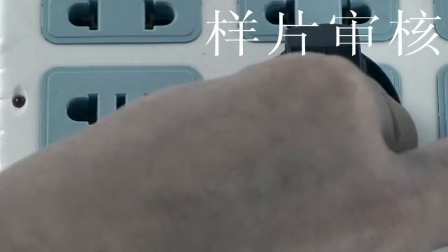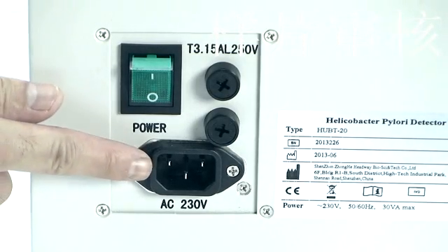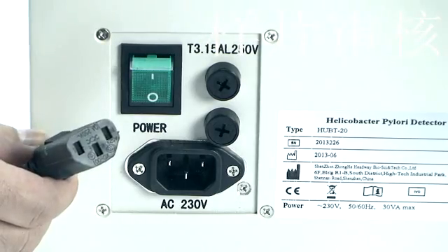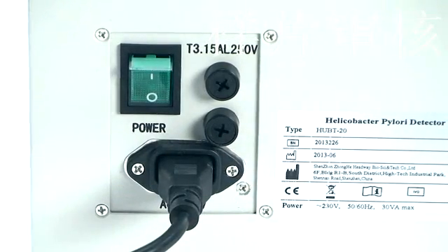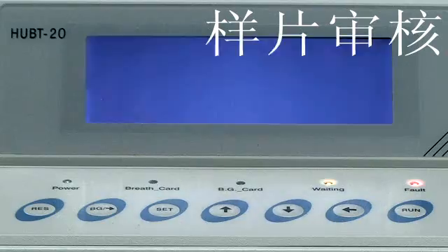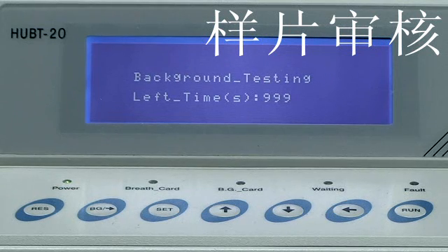Take out the power cord and connect it to a 220V 50 Hz AC power supply. Then turn on the power button on the back of the device. The indicator light on the platform will turn on, and the device will automatically enter background calibration, counting down 1000 seconds.